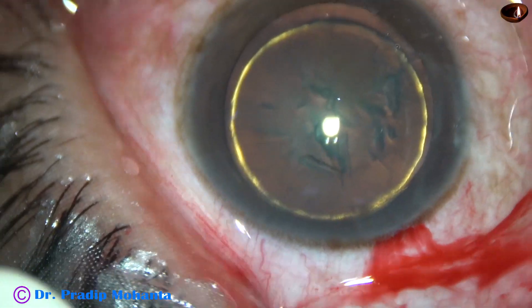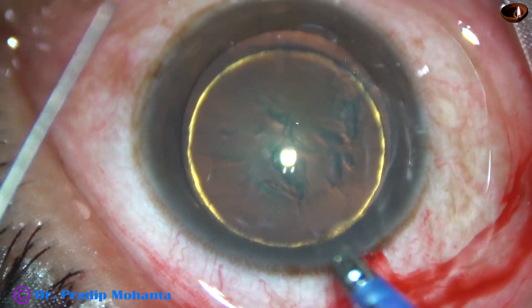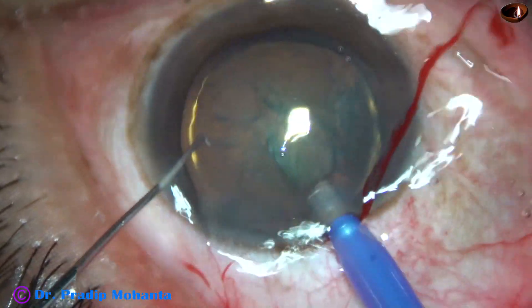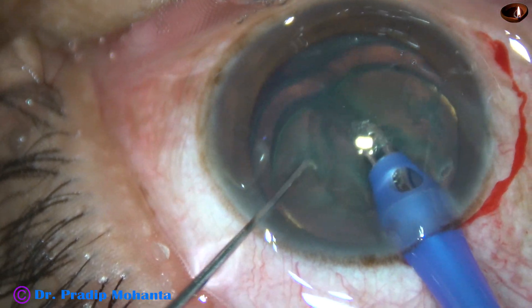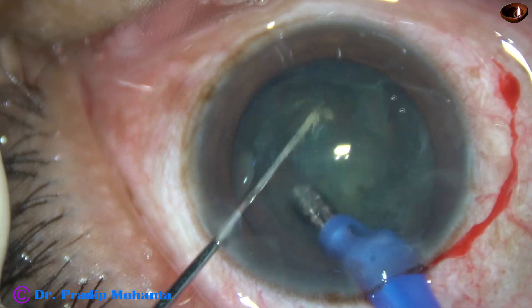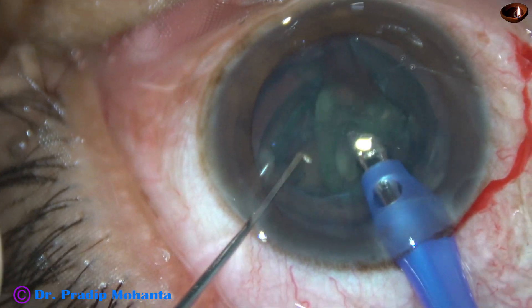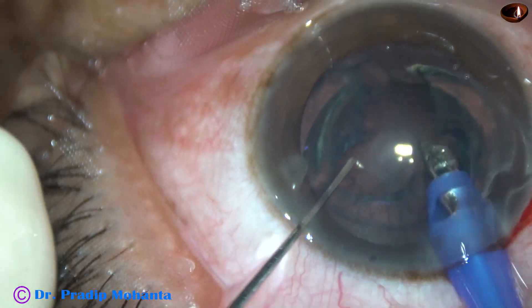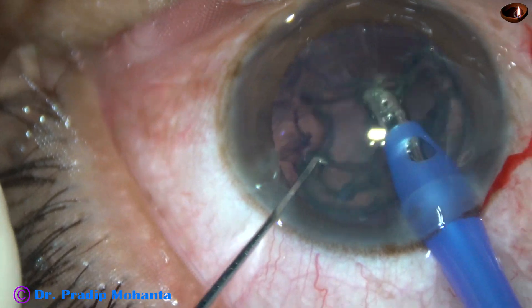So I did hydrodissection and hydro-delineation. And now I go in with about 400 vacuum, 40 flow rate, and 50% ultrasonic energy. I just start aspirating the lens matter. The nucleus is very soft — just by vacuum, it came to the tip, and I applied a little bit of ultrasonic energy and could emulsify the lens matter very easily.